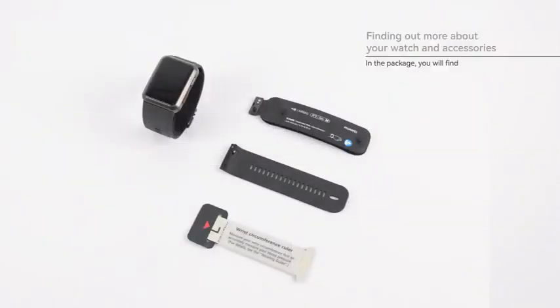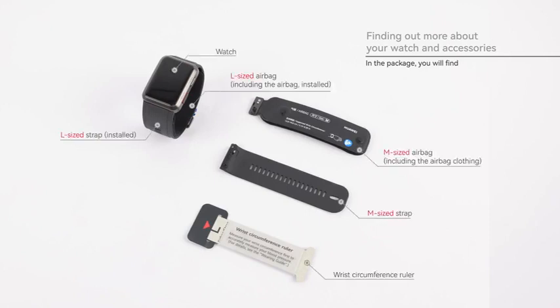Finding out more about your watch and accessories. In the package you will find your watch, M and L sized watch straps and airbags, and a wrist circumference ruler.